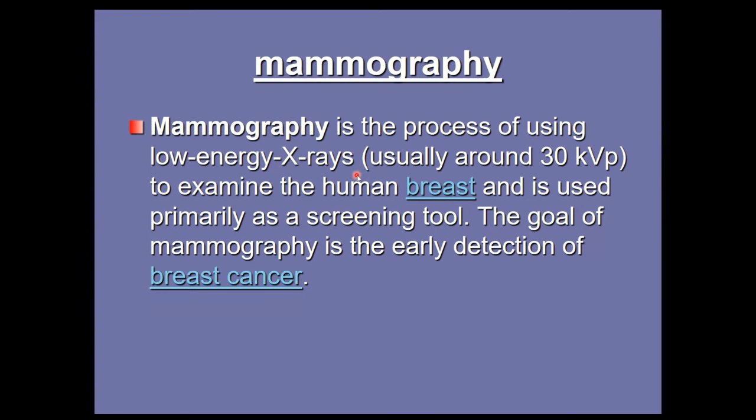And also the other advantage of using low energy X-rays is that breast tissue is sensitive to radiation, so we are giving low energy X-rays, so there are fewer chances of development of breast cancer due to imaging.